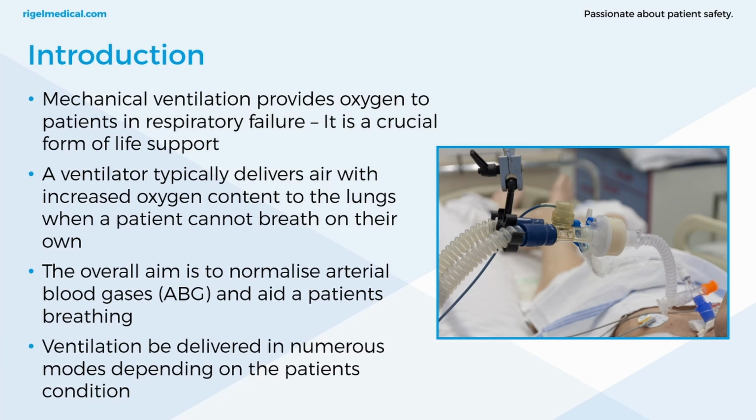Now, ventilation can be delivered in numerous modes depending on the patient's condition. And the different modes are really important for understanding ventilator testing, and we'll come on to that, because it can affect the way trigger levels or mode should be selected on the ventilator analyzer itself.